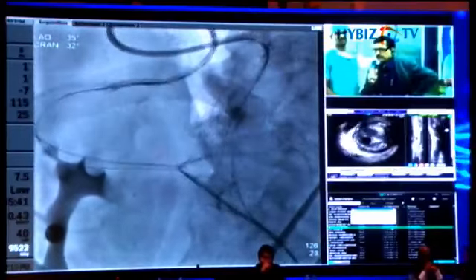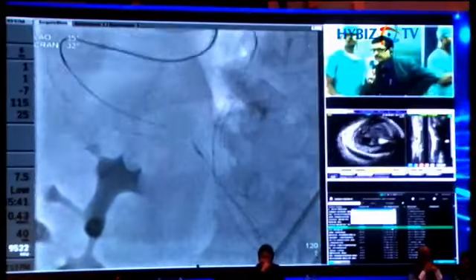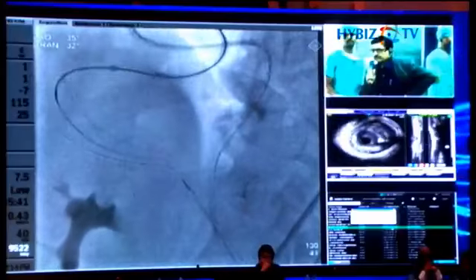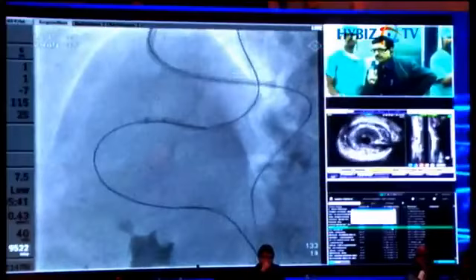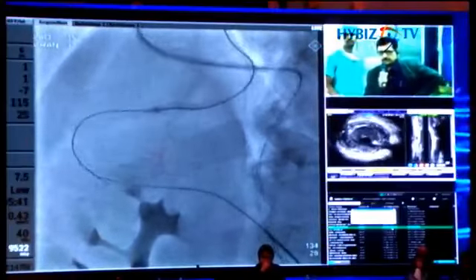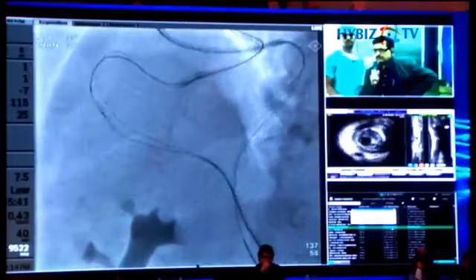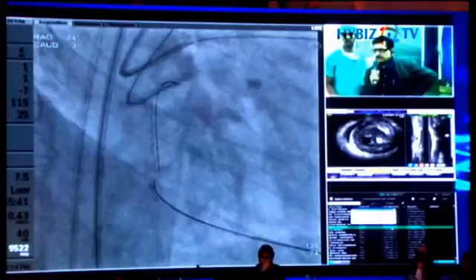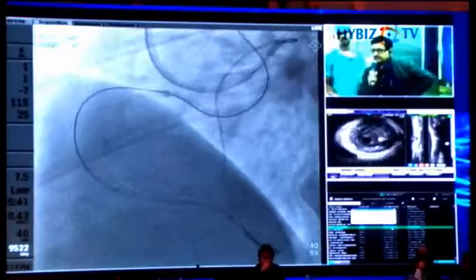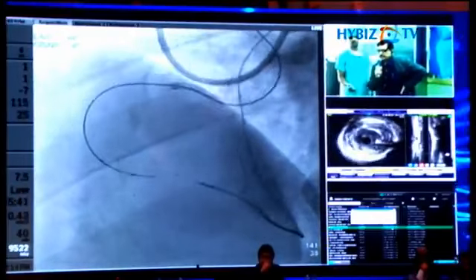We then tried a reverse CART also. We tried Ultimate Bros, then the Miracle 3 wire. We did the reverse CART with a 2 to 2.5 millimeter balloon at the site of the CTO segment, and we did an IVUS. But it was difficult to negotiate the Miracle 3 wire up, and to capture it I used the Guideliner again.